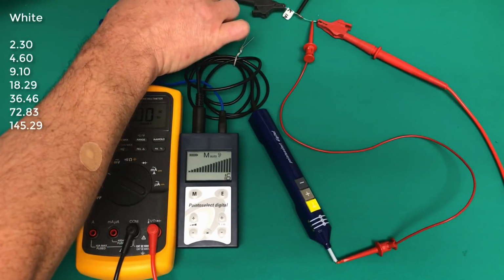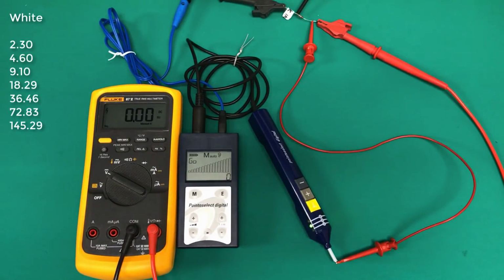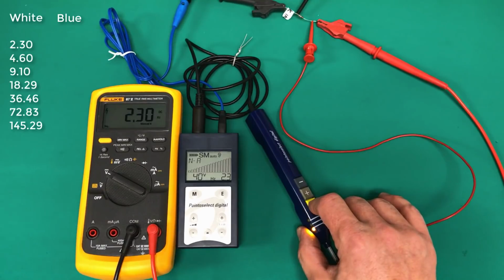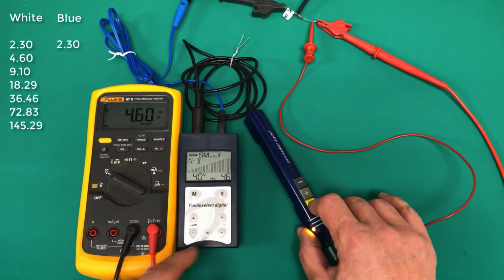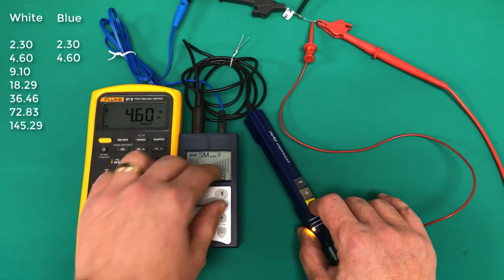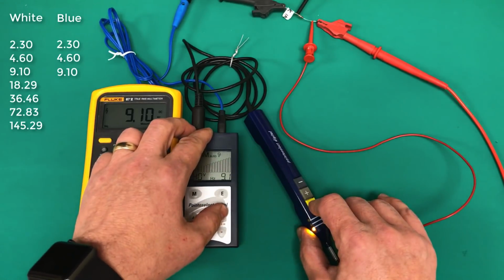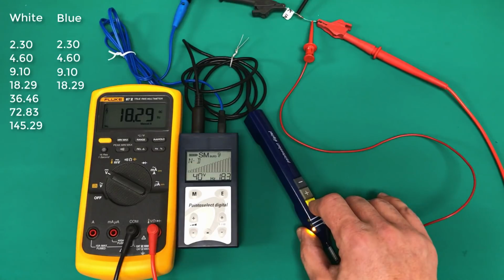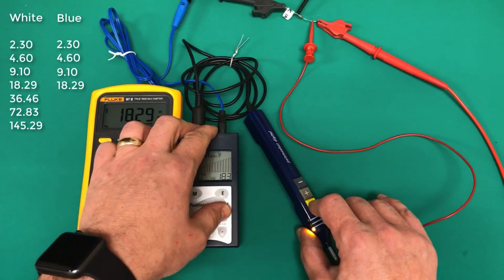So I'll hook this up, getting good conductivity through our load resistor, our 1K load. And so let's start with stimulation. 2.30, 2.30, perfect. 4.6, 4.60. 9.1, 9.10, right down to the hundredth. 18.3 gives us 18.29. It's off by 1/100th of a hertz, just like the white unit was, exactly the same.